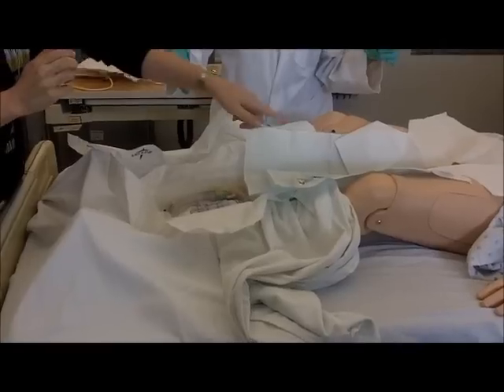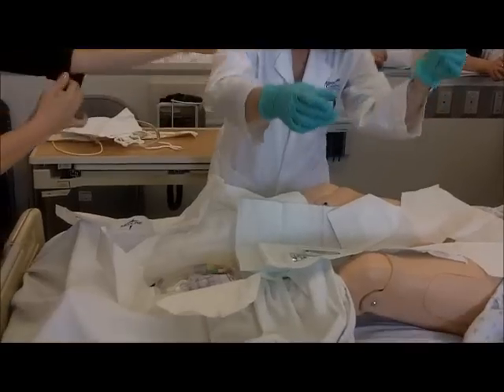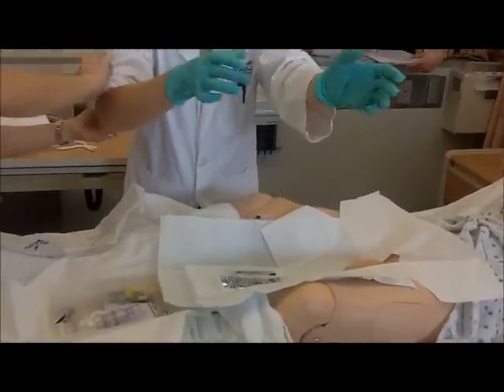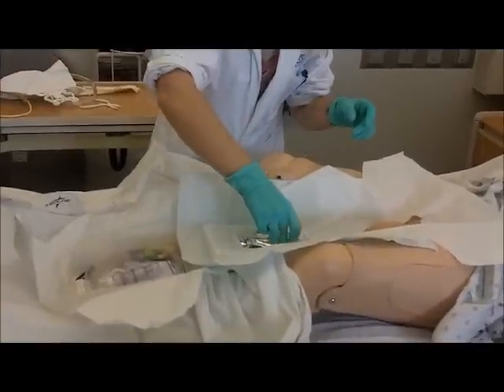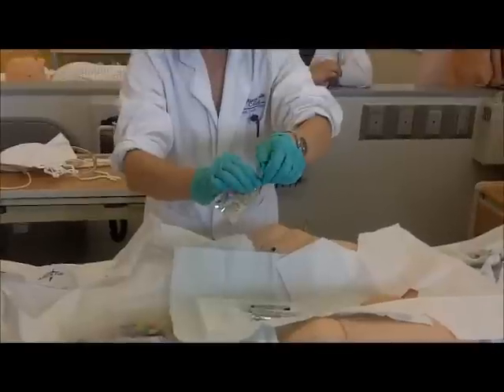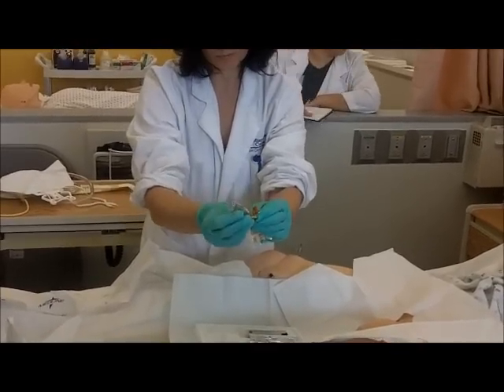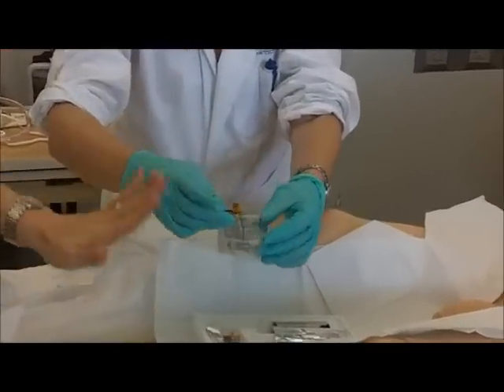I know, I was like whoa. You need to open up that. Make sure, if you need to roll up your sleeves, make sure your sleeves are rolled up so nothing touches that. Okay, I'm bringing it hot. Just open that all the way and just place it on your tray. Just place the whole thing — everything's sterile — just drop it on your tray.